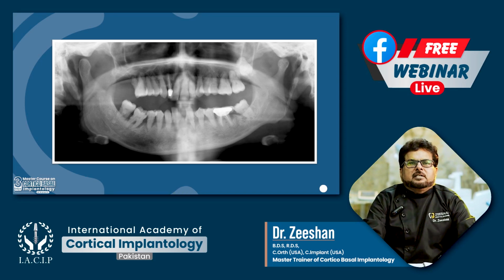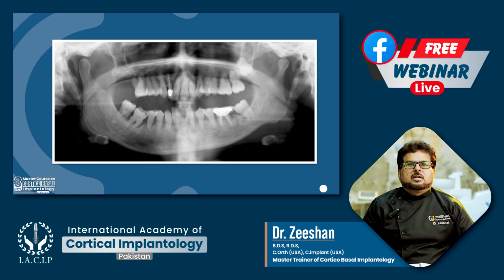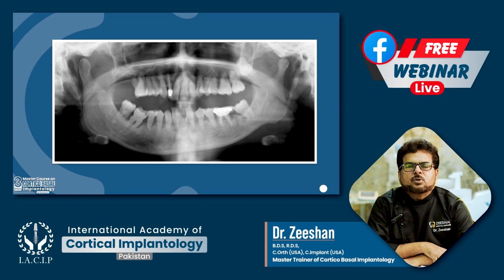How to achieve that immediate loading in this case, where the sinus is so low, we don't have any bone? How to bypass our sinus? This we have to learn to achieve primary stability in the immediate loading cases. So how to bypass sinus and how to bypass the inferior alveolar nerve, lingually or buccal bypass, the two bypass systems we are going to discuss.